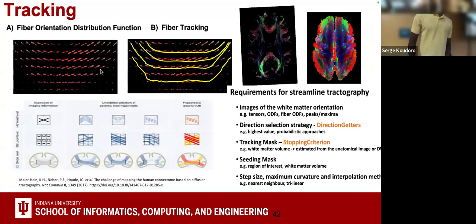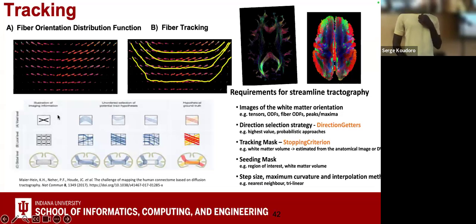So the big challenge of tractography is, of course, when you encounter a different intersection. Here in the classical case, there is a nice paper talking about how we can improve tractography to avoid a false track. And it's not obvious, because when you have a discrete grid here, you have multiple options. What do you do? Do you pass just straight away? Do you pass like this in diagonal? Do you just go down and go up and then? So this is the biggest challenge right now of tractography: how you describe this kind of area.